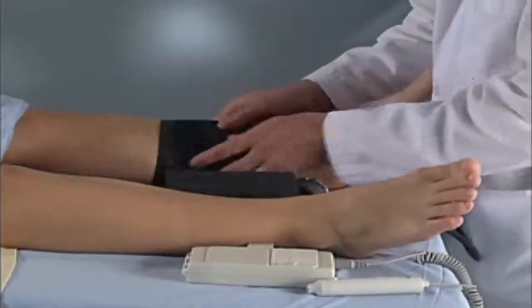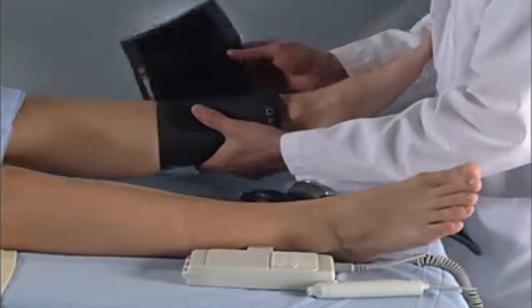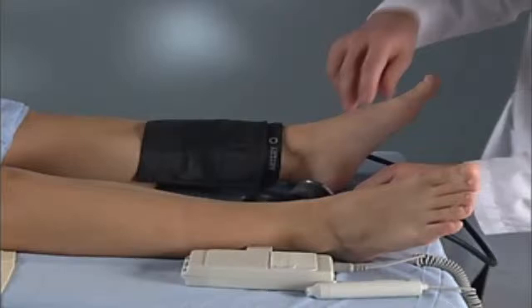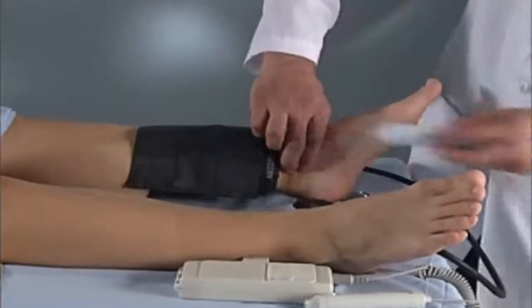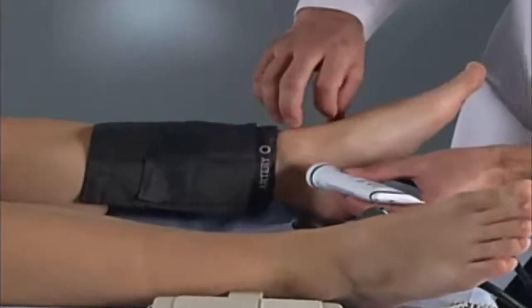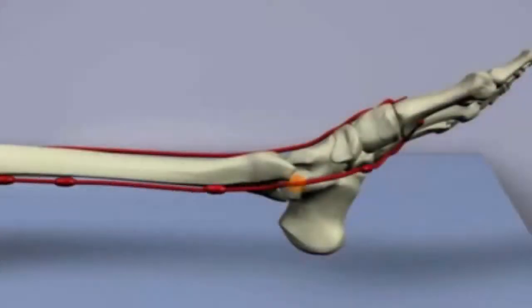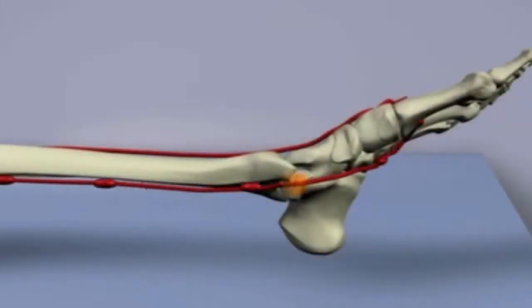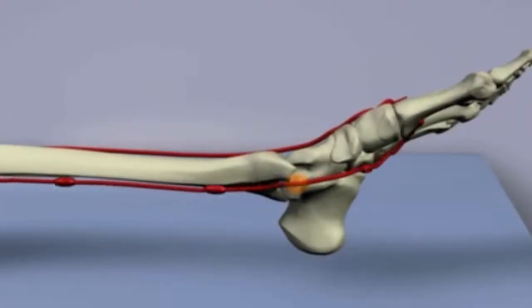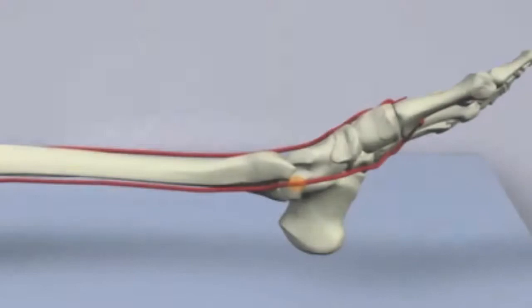Measurement of the ankle brachial index represents a non-invasive and objective way to diagnose peripheral arterial disease. This test has been reported to have more than 90% sensitivity and more than 95% specificity for the diagnosis of peripheral arterial disease. This test may be performed in the physician's office and is a helpful adjunct for diagnosing peripheral arterial disease.